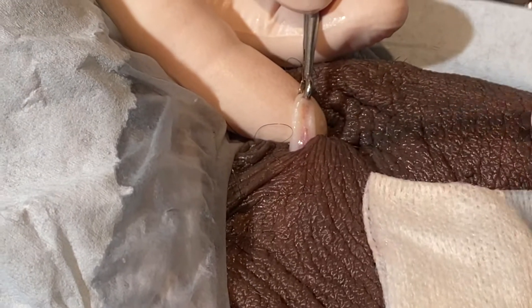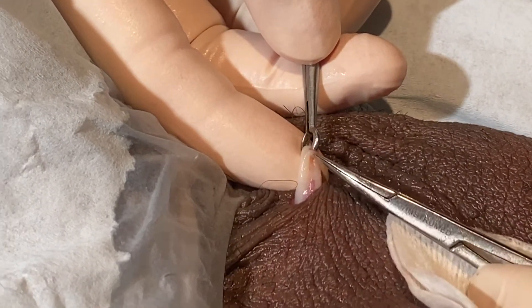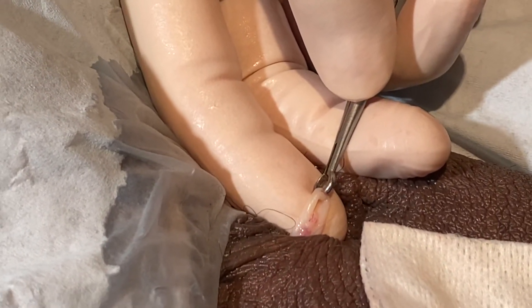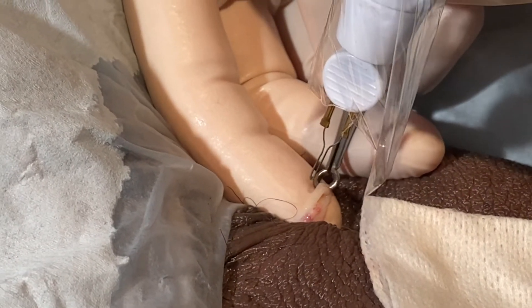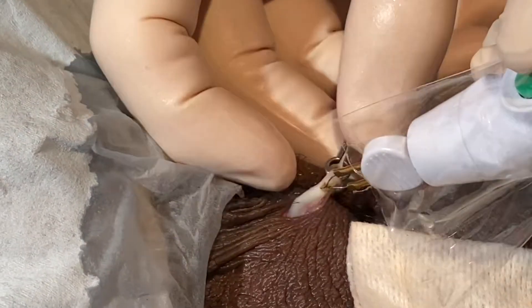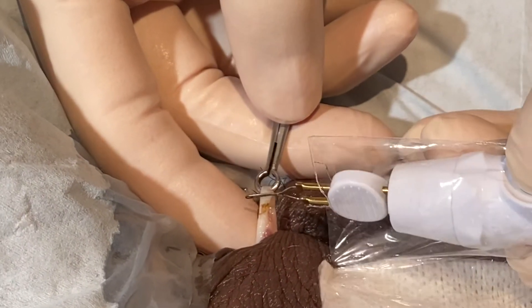There are some people who just like to live life without kids. Here we're doing four steps: isolate, cauterize, divide, and separate. Still working on my index finger technique. I find it very helpful to cauterize the inside. You can hemitransect the vas — I find it a little bit quicker to just make my entry site. With some people, press this together as though sealing the two ends.